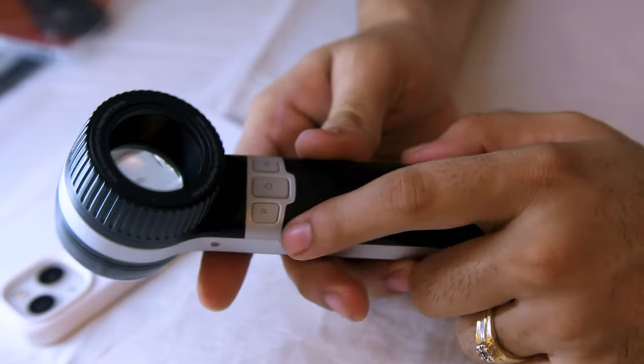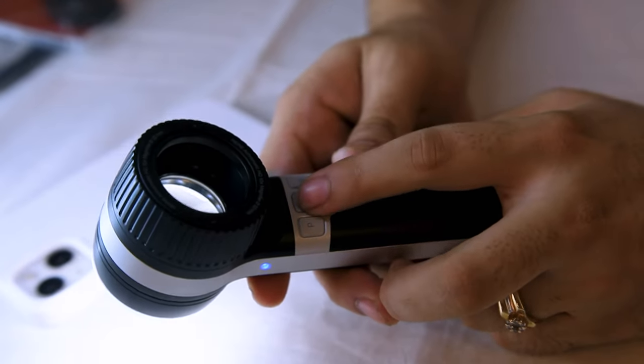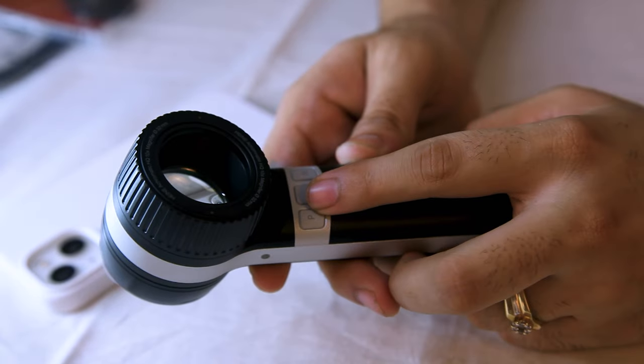First of all, there is the on/off button which turns the light on and off. Second is the brightness control button.